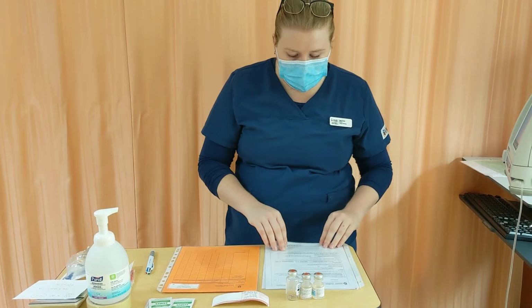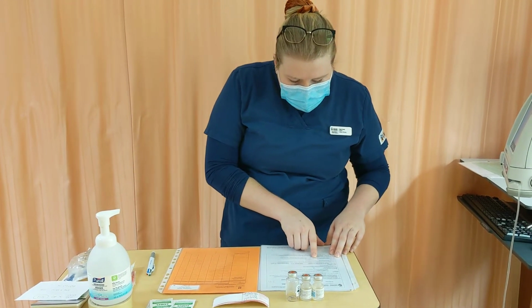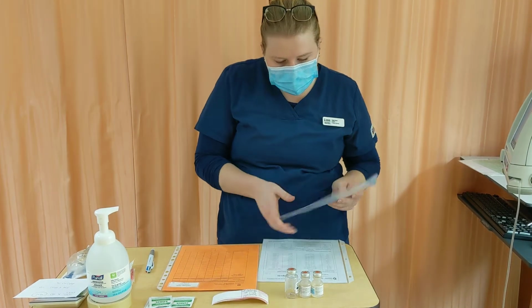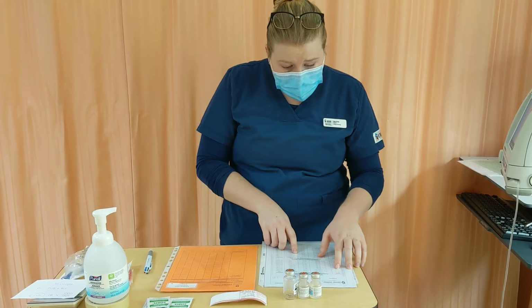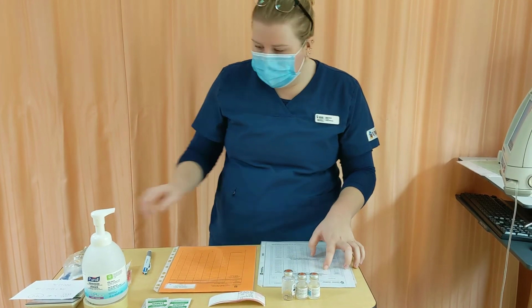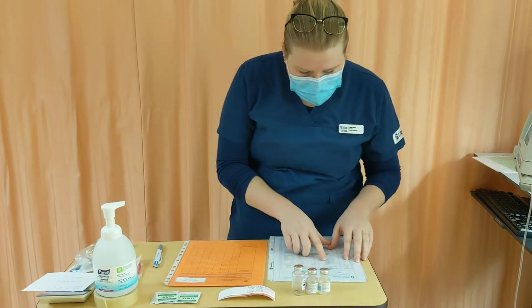So like I said, I'm going to be giving 10 mLs of the medication. So we have IV intermittent peripheral, so I'm going to see this graph here. We don't have any fluid restrictions and it's a peripheral IV. So we're going to be doing 500 milligrams in a 100 ml mini bag. So I have my 100 ml mini bag here.